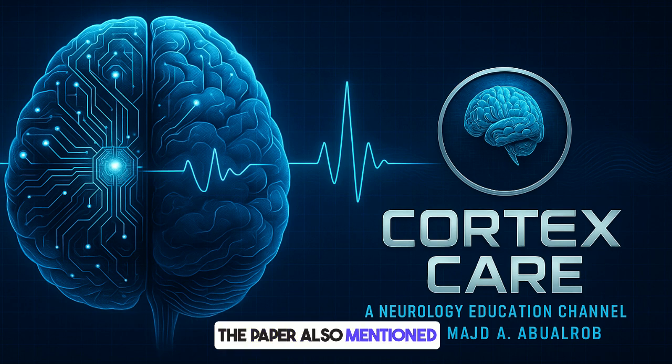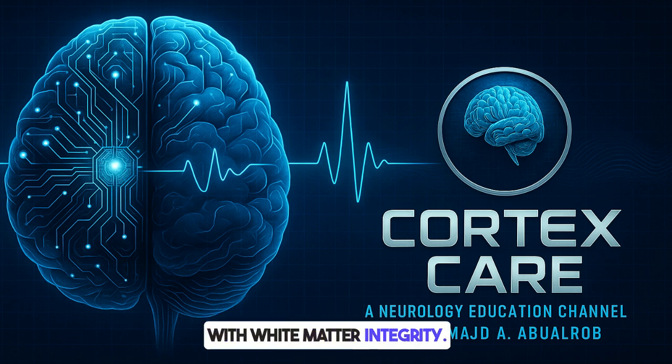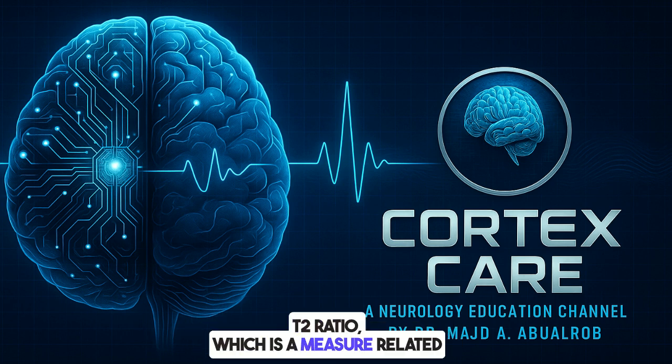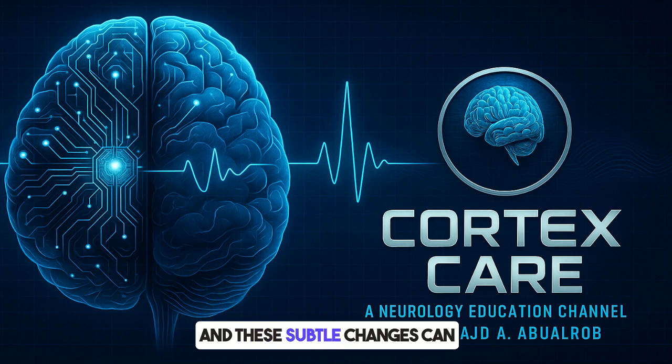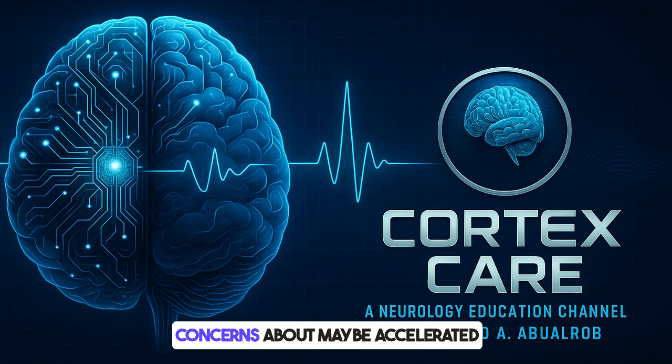Okay. The paper also mentioned advanced imaging. What extra information does that give us? Things routine MRI might miss. Yeah, advanced techniques can pick up more subtle stuff. Structural changes like slight hippocampal volume loss or issues with white matter integrity, basically the health of the brain's wiring. And functional changes like disrupted brain networks. They mentioned things like the T1-T2 ratio, which is a measure related to myelin content, being reduced in white matter tracts. I see. And these subtle changes can sometimes stick around long-term, even after immunotherapy, raising concerns about maybe accelerated brain aging down the road.